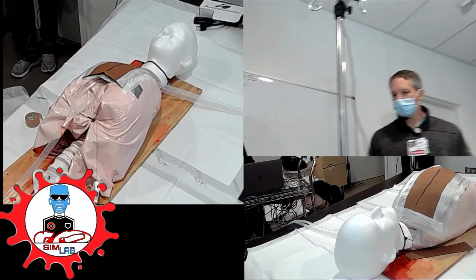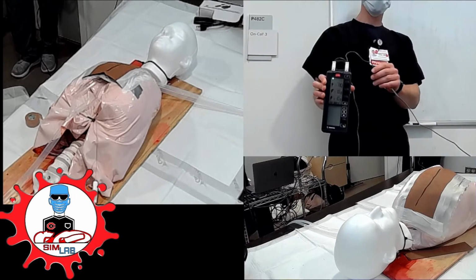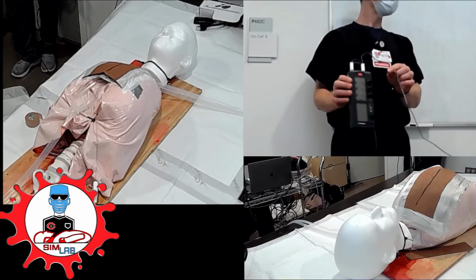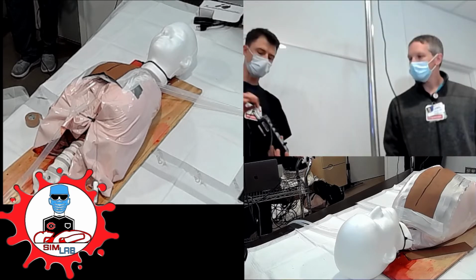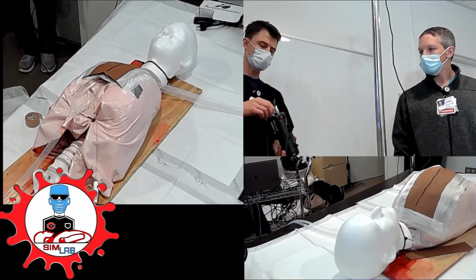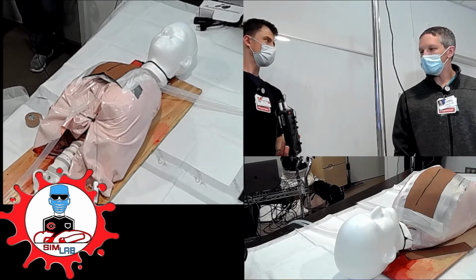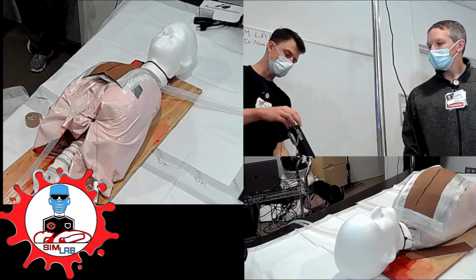It just means you're basically pacing, and you're not looking for any intrinsic activity. So you're asynchronously pacing. It's going to asynchronously pace both V and A wires if they're hooked up, right? Do you care if it only has V wires and there's something in here or not? No, you don't care, right? Just whatever's plugged in. It's fine. All right, so you hit DOO, right?